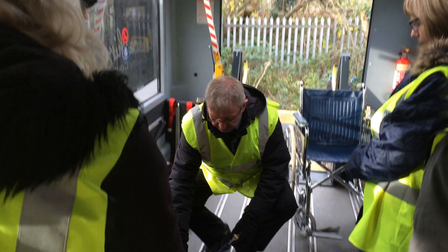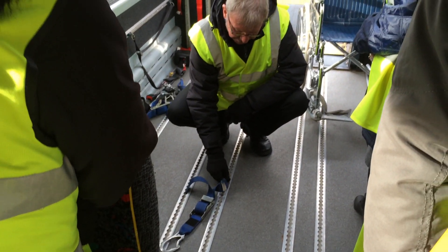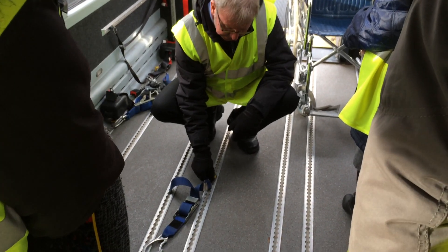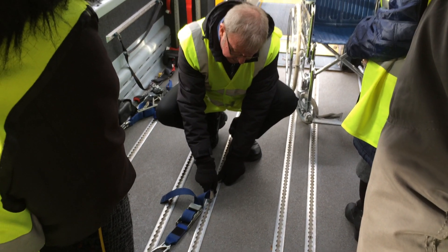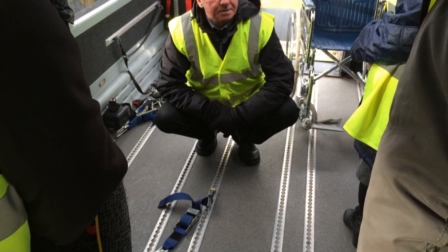People really struggle getting them in, but it's very easy. All you've got to do is put it over the tracking like that, and then all you do is put your thumb behind and press, and it'll go in.